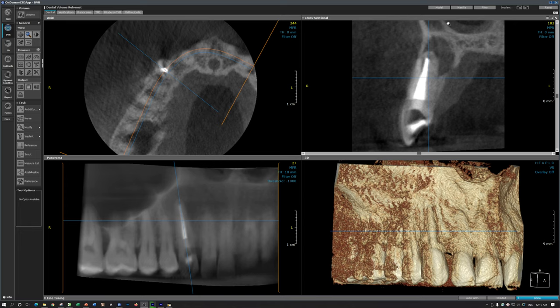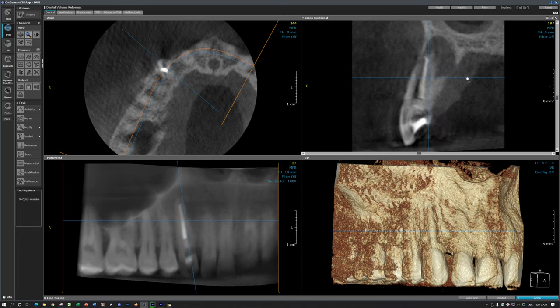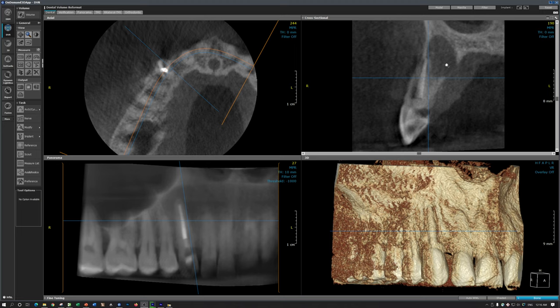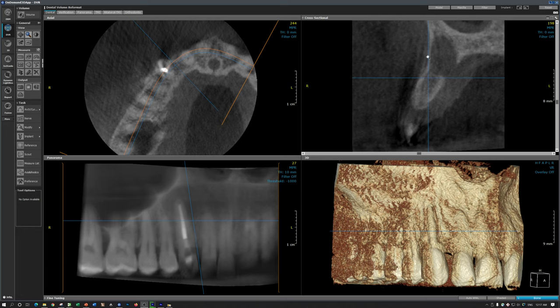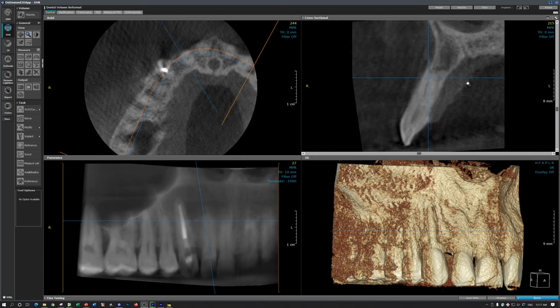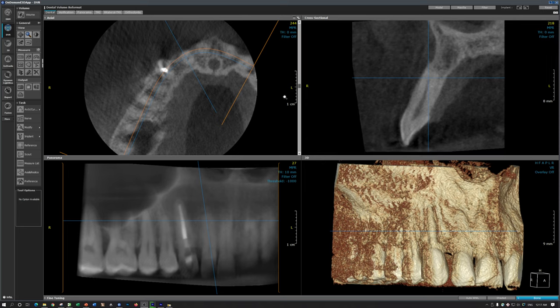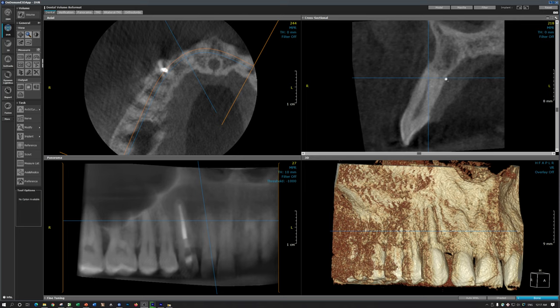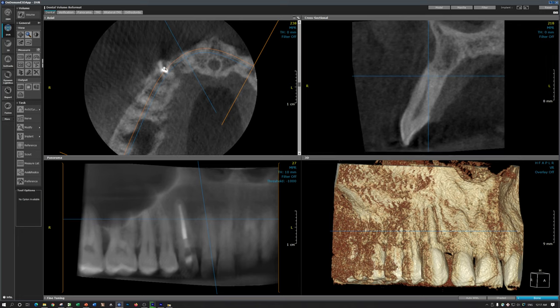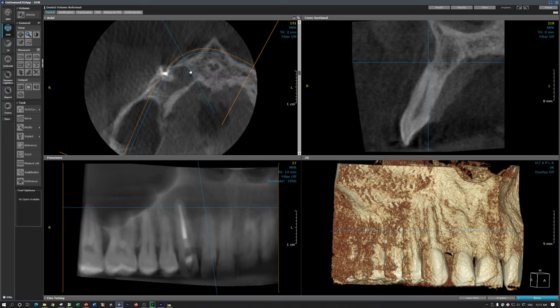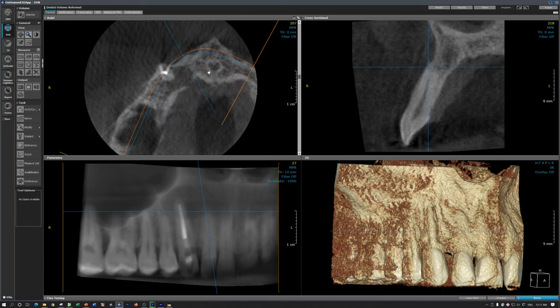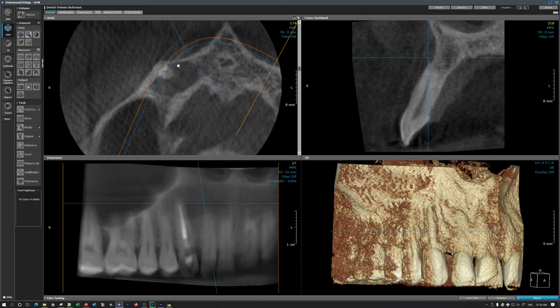This is the floor of the nasal fossa. Coming further mesially the palatal cortical plate is disrupted; the soft tissue is slightly enlarged. We can see slight expansion of the labial cortical plate and perforation of the palatal cortical plate, reaching towards the lateral incisor. On the axial view we can see the oval appearance of the cyst, the area of perforation, and the nasopalatine canal. Further superiorly this is a fairly smooth, well-defined cystic lesion adjacent to the right maxillary sinus.